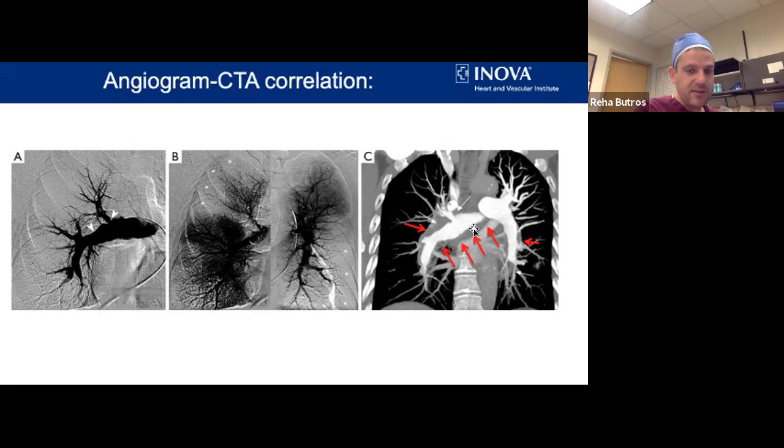With the more subsegmental vessels, you're not going to have a lot of information, but I think over time it's going to take over VQ scans, probably. Even now, I think it's so much more information. With VQ scans, you say, okay, in the lower lobe somewhere, but you don't really know what segment that is, and it's very subjective in my opinion. The dual energy CT gives you much more information, especially when it's superimposed with the anatomical vessel information.